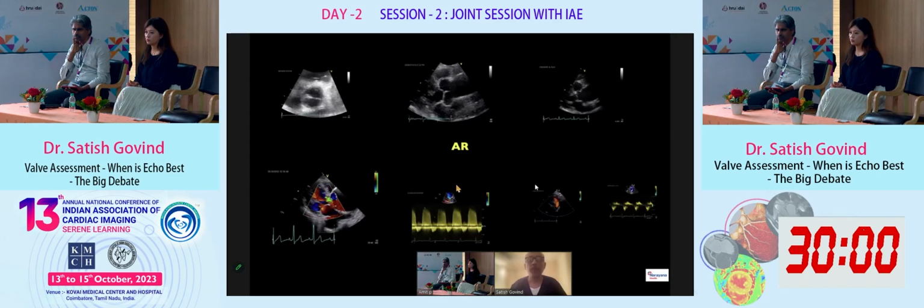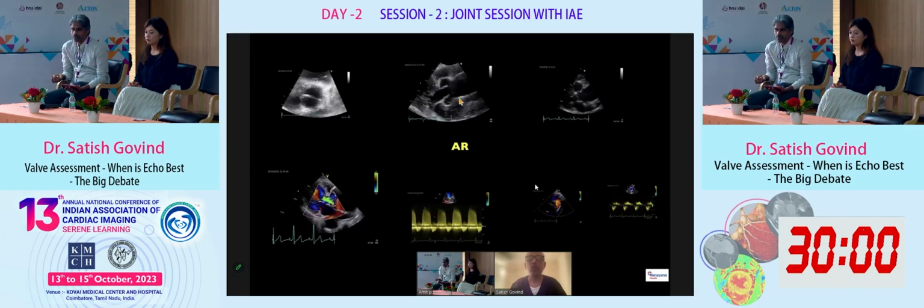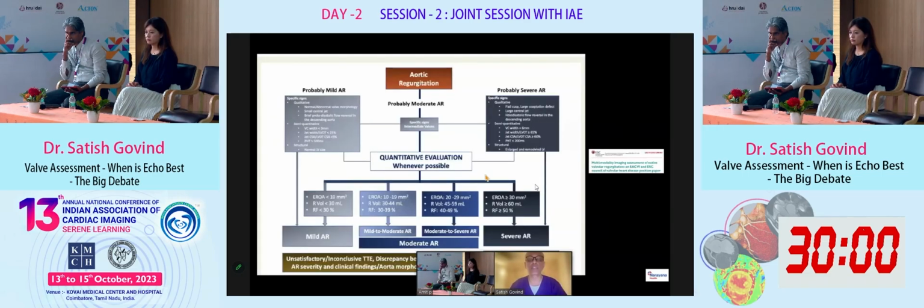Next, we move on to aortic regurgitation. Echo is fairly useful in understanding the morphology. For example, if it's a bicuspid valve which is causing it, or looking at the aortic root, which is the mechanism, or looking at the ascending aorta. And then again, to some extent, though not always, you can identify the proximal type A ascending aorta dissection here. And then there are various parameters to quantify the severity of the AR. And again, this is the roadmap, the same sort of process. I'll not go much into the detail, but this tells you how we should go as far as the algorithm is concerned: 2D, various quantification methods, trying to identify mild, moderate, severe.